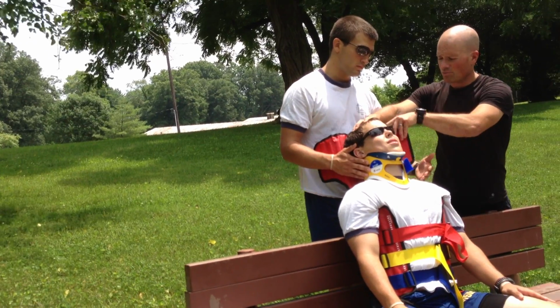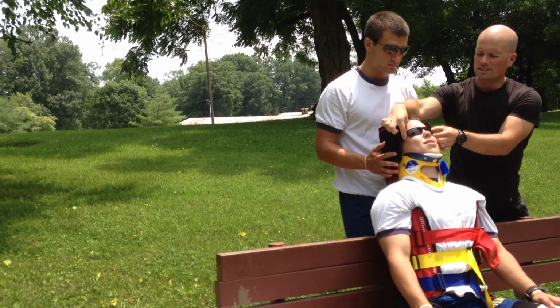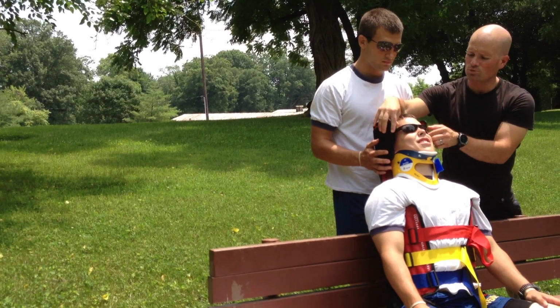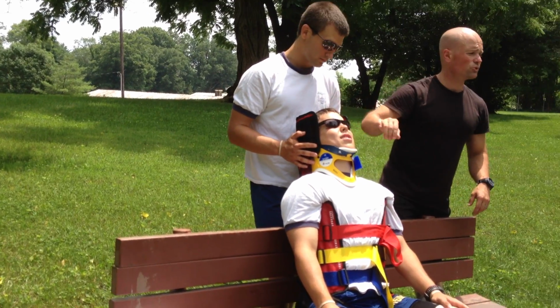I'm going to just put this here and hold that in place. Same thing on this side. Alright, loving that. These might get a little crushed. So, well, I'll tell you what. We'll just be gentle, because you want those on. Two methods as well here. We need to secure the head.